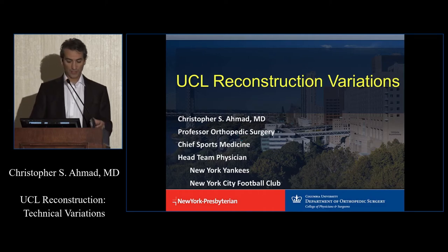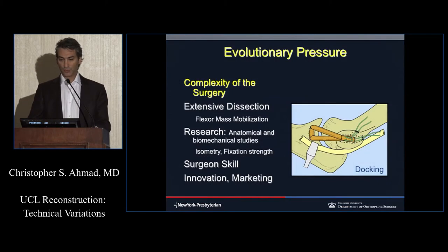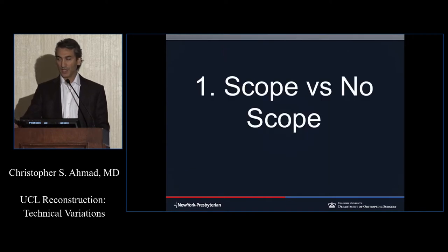Okay, UCL reconstruction variations. This is a cool topic. The reason is when it first started, this operation by Dr. Jobe, it's undergone some evolution and change. Because the surgery was hard and technical the first time around, and we've done more and more research, learning the anatomy better, the way to approach the ligament, and how to fix it. And skills have been changing, evolving, and there's also been innovation in marketing from companies on how to do this operation. So I'm going to go through a couple of the variations, the options that we have in taking care of them step by step.